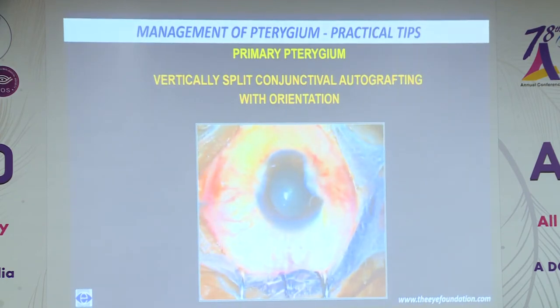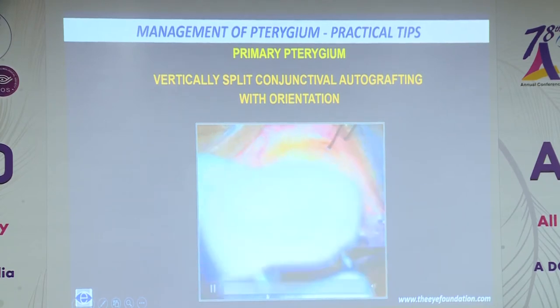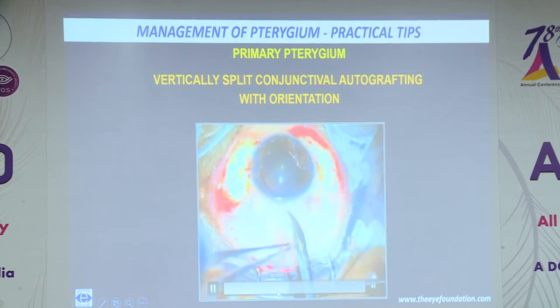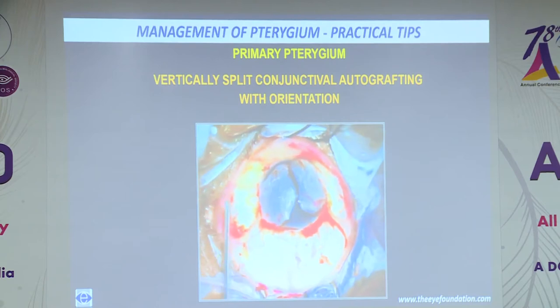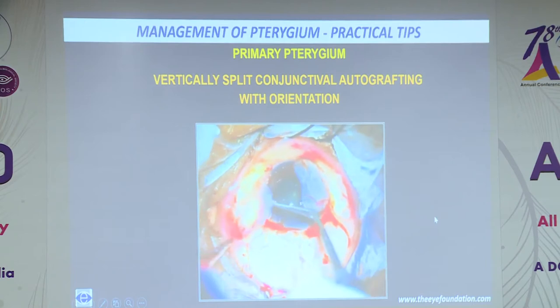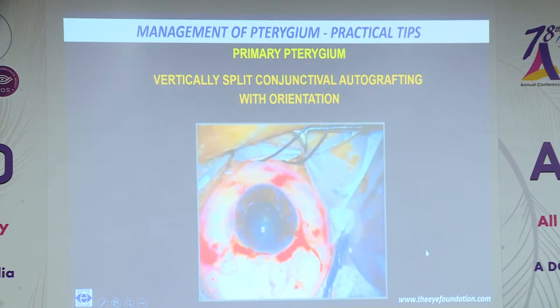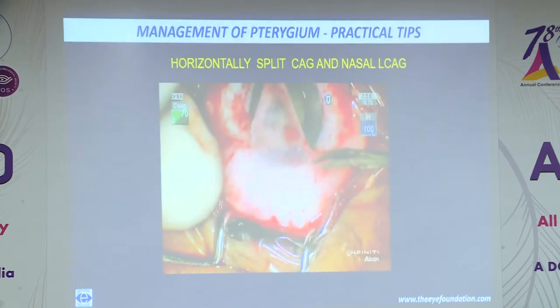So this is another case where I am demonstrating vertically split conjunctival autografting with the limbus to limbus orientation. If you have a large donor area superiorly, you can split the graft into two parts, and you can still maintain the limbus to limbus orientation and place the graft on the bare scleral bed. It works very well.